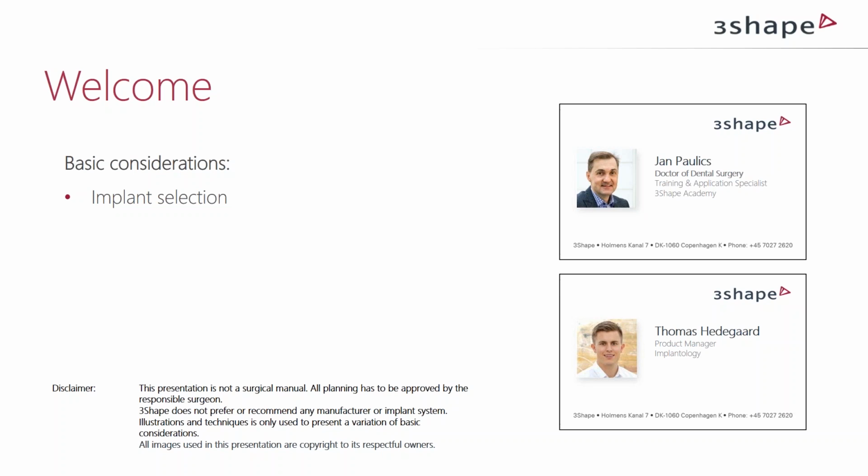So we have some questions on the agenda today. We would like to talk about how to select the right implant when doing implant planning, how to place the implant correctly, and finally how to place them so we can distribute the forces from the mouth and from chewing.